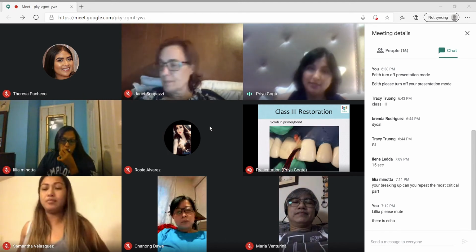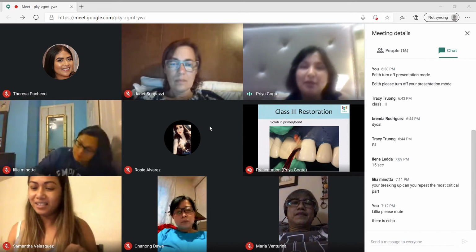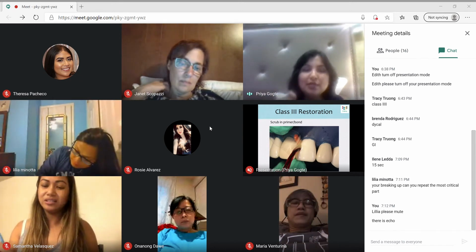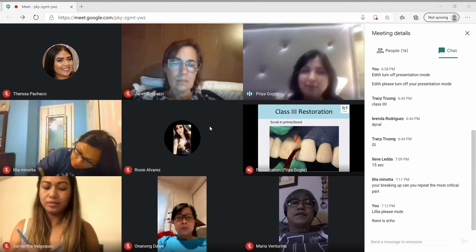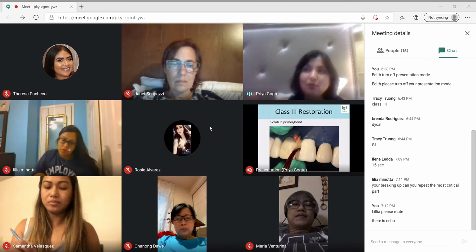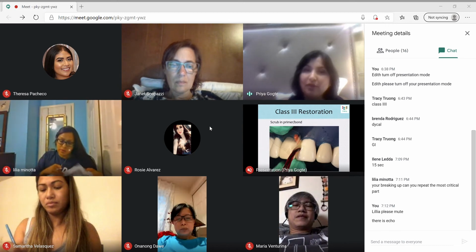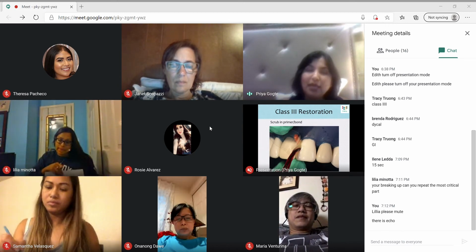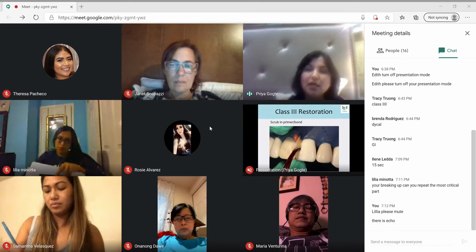Now with the bond. So that's another thing I also learned is that when you're putting prime and bond, make sure you, with the micro brush, you put the prime and the bond. Now, whether you are using one step or you're using two step, doesn't matter. But you have to apply primer nicely. That's why at one stage they taught us apply primer 2 or 3 times because we would get lazy and we would just apply once quick and then be done. So you want to apply for maybe 20 seconds or so, prime and bond.